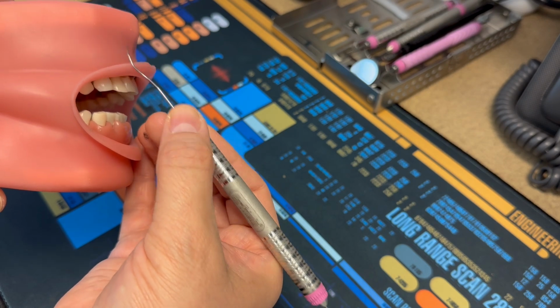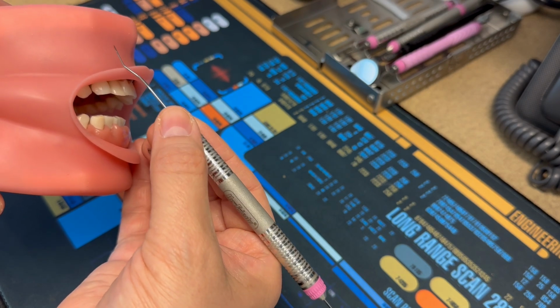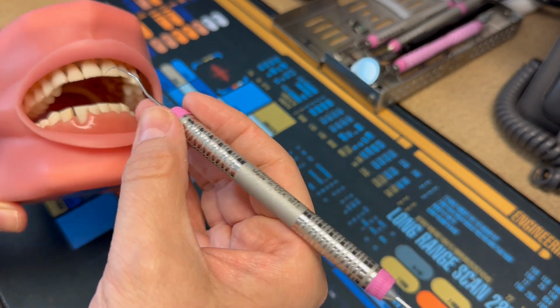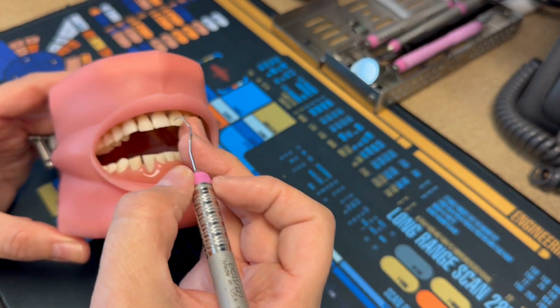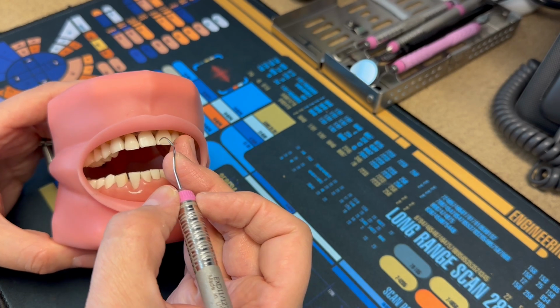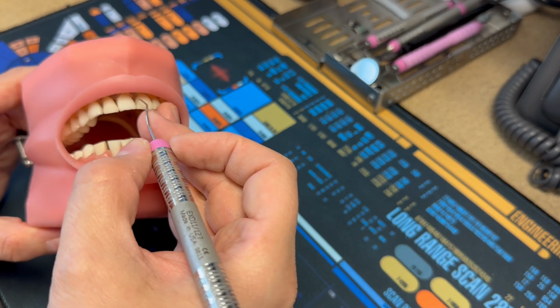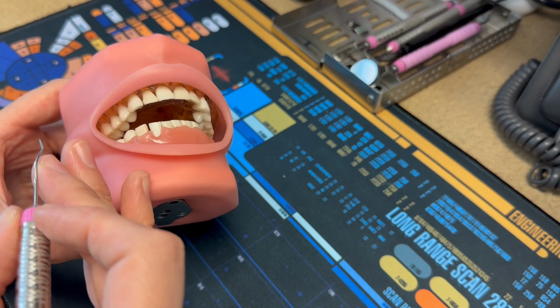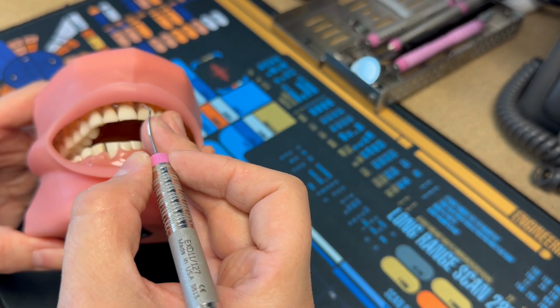The root. So remember that there's going to be an inclination inward of the root for maxillary teeth, mandibular teeth, all except the posterior mandibular molars. Anyway, so you're going to look kind of straight. Your positioning is correct for your patient, and then you're going to go in and actually check.